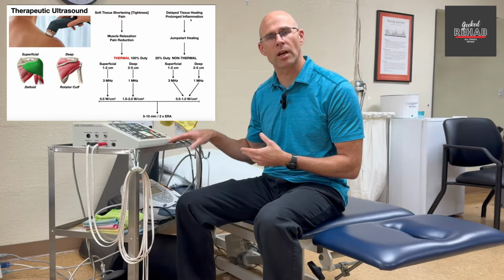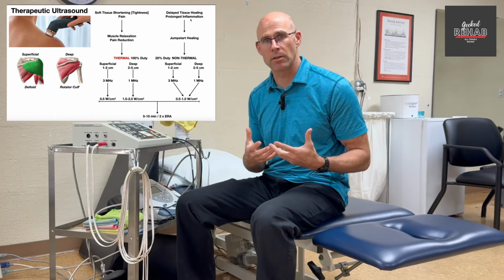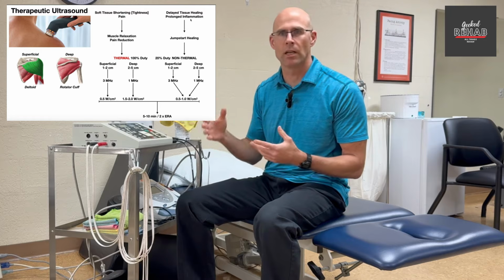Those sound counteractive though, right? You don't want to add heat to cause inflammation. Well, there are different settings. You can put it on 100% ultrasound, meaning that ultrasound beam is going 100% of the time. That's going to create a deep heat. Now, if I put it on pulsed setting, I can do 20%, 50%, some settings are 10%. The ultrasound is only going for 20% or 50% of the time. Either way, those do not create heat. It's pulsed, so it's not going to accumulate heat.